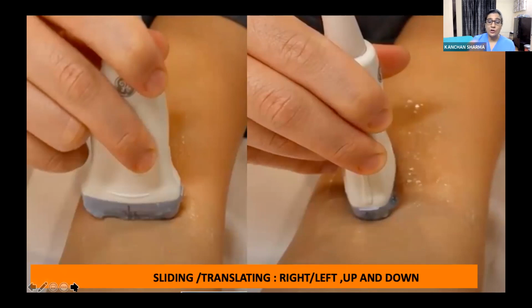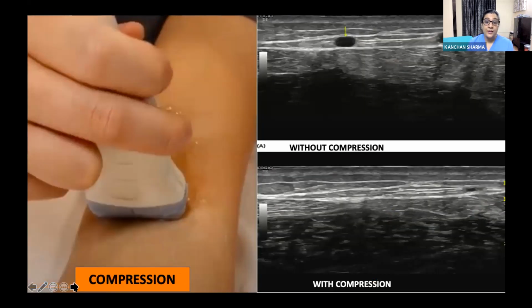Sliding the probe means you're just trying to move it from one position, either right, left, or up, down. In some books they say it is translating the probe, but they mean one and the same thing, right? Okay. Then there is a third maneuver, compression. Compression means applying pressure with your probe.